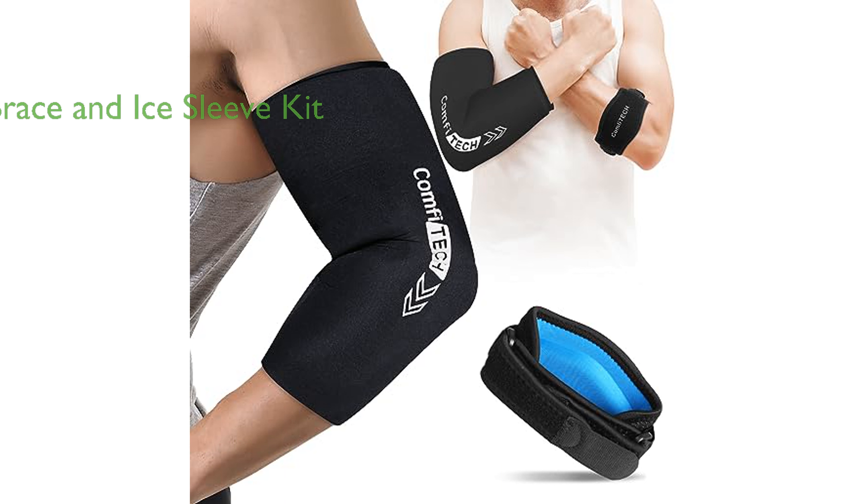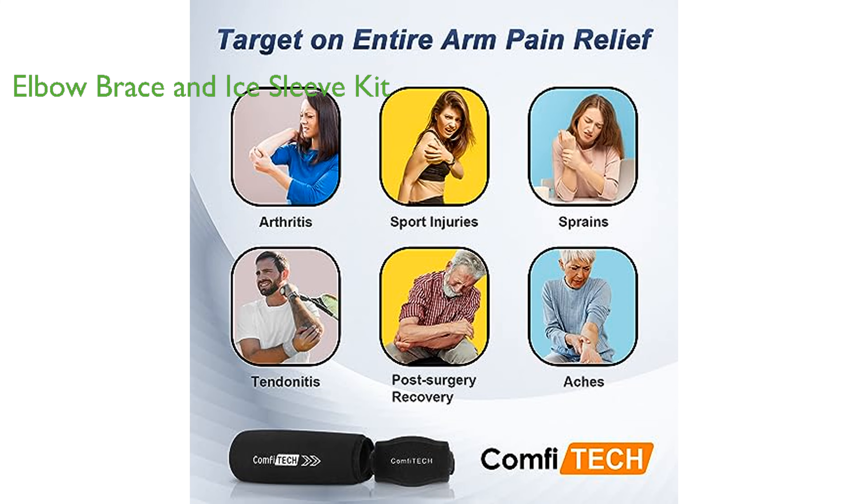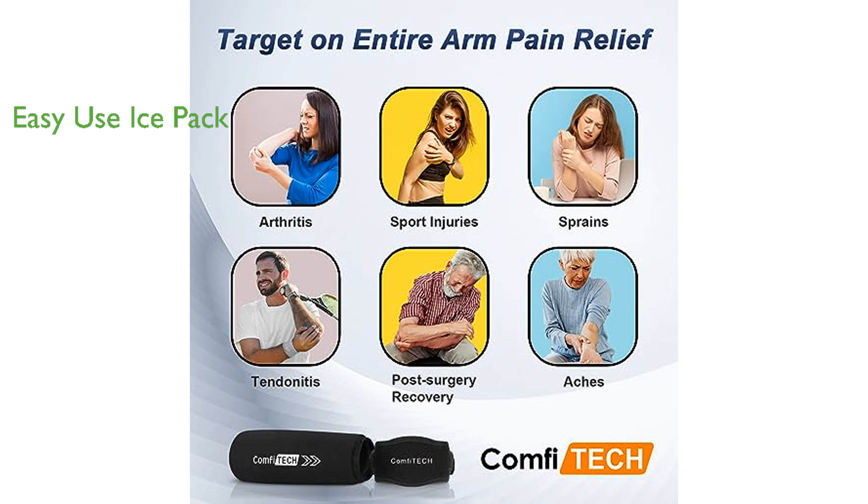The set includes a unisex elbow brace and an ice sleeve kit, which together offer protection for the arm, elbow, and tendon, and provide cold compression therapy for faster recovery.